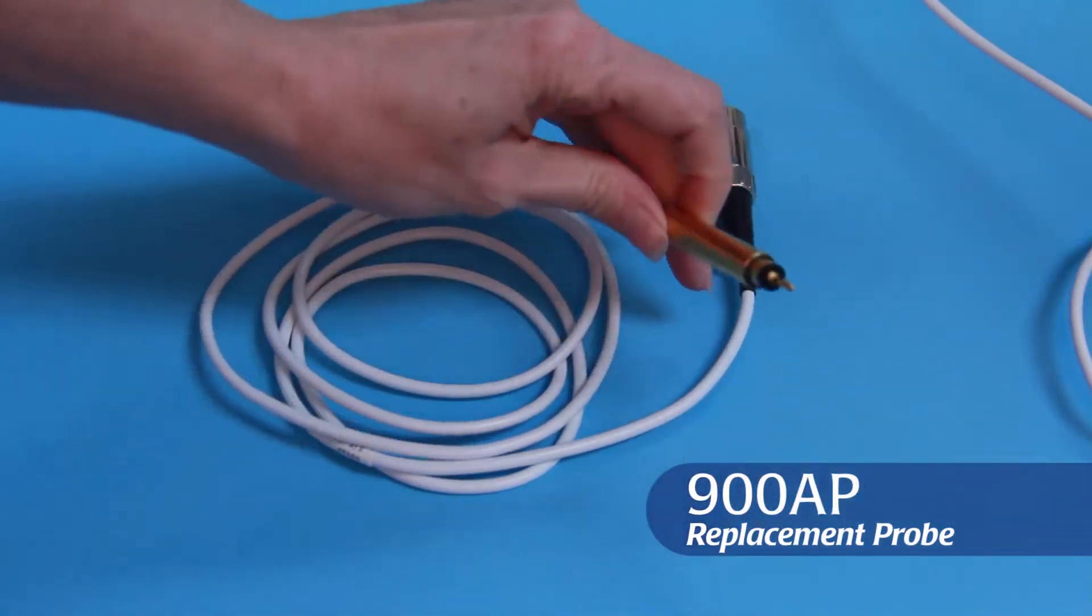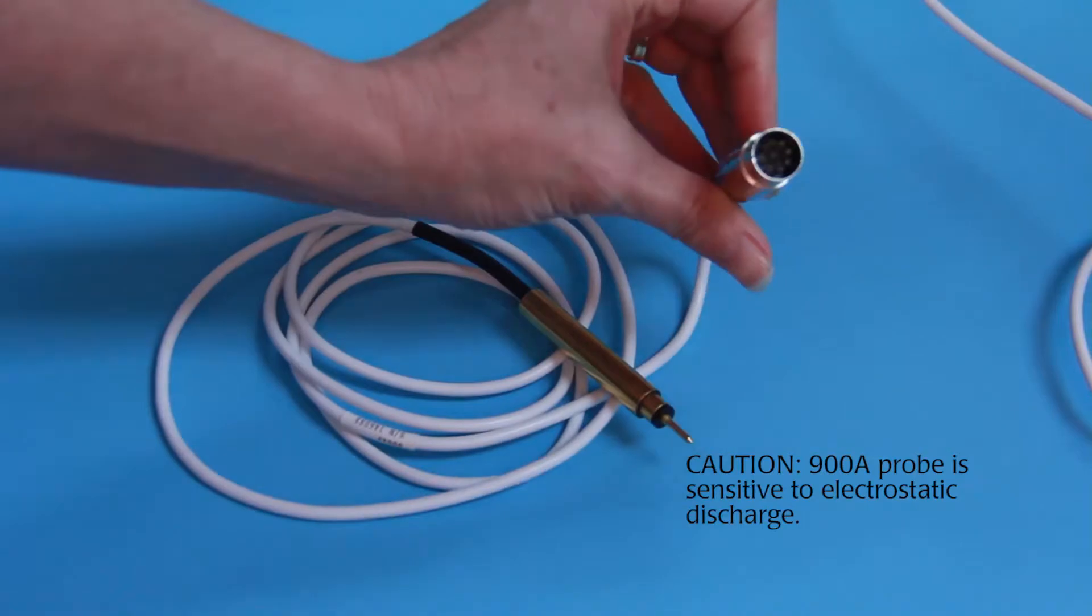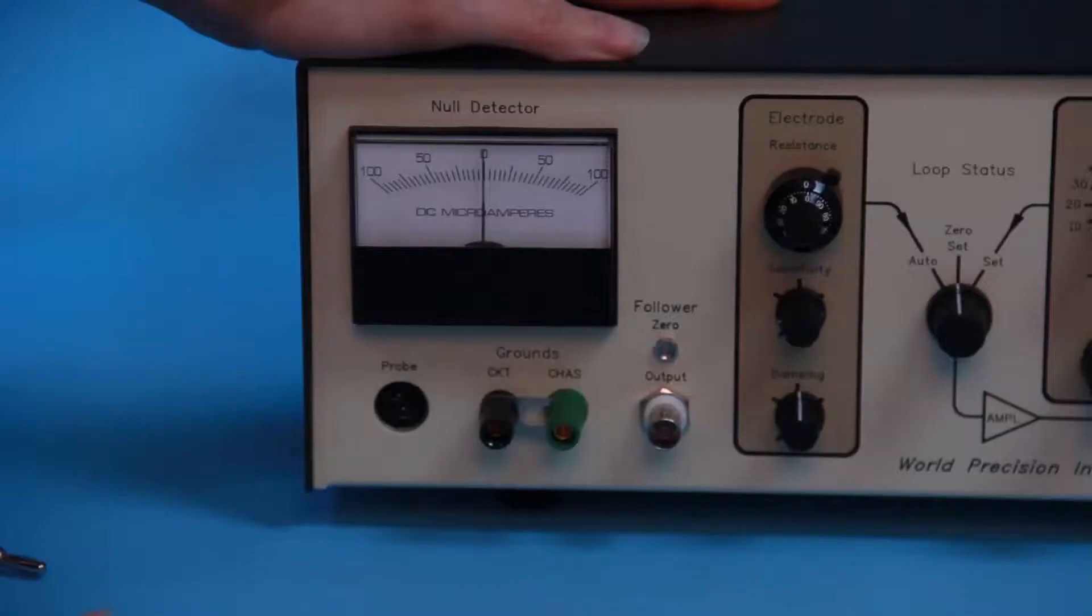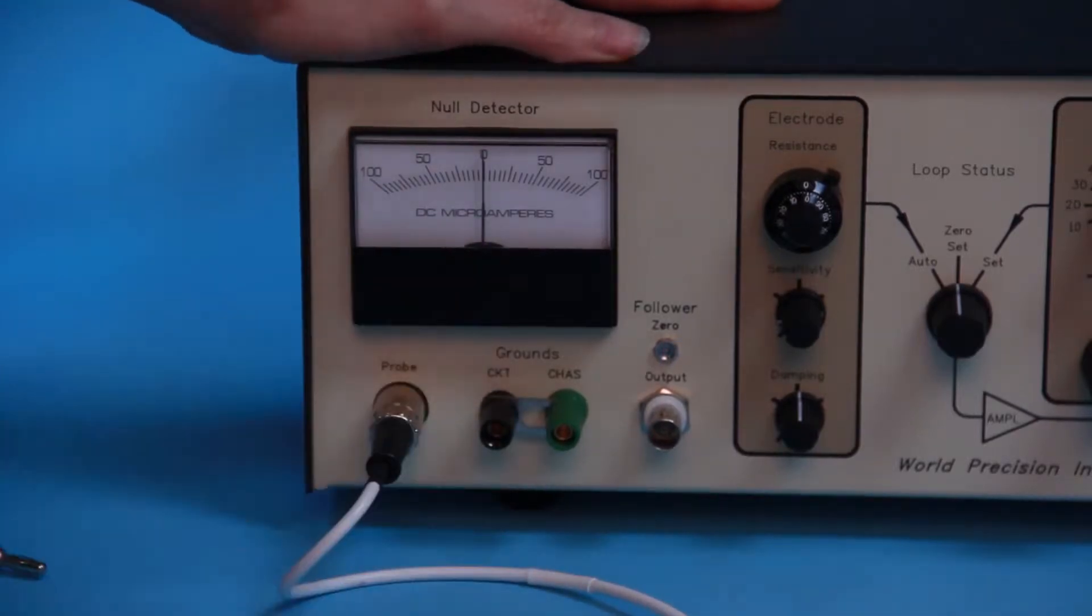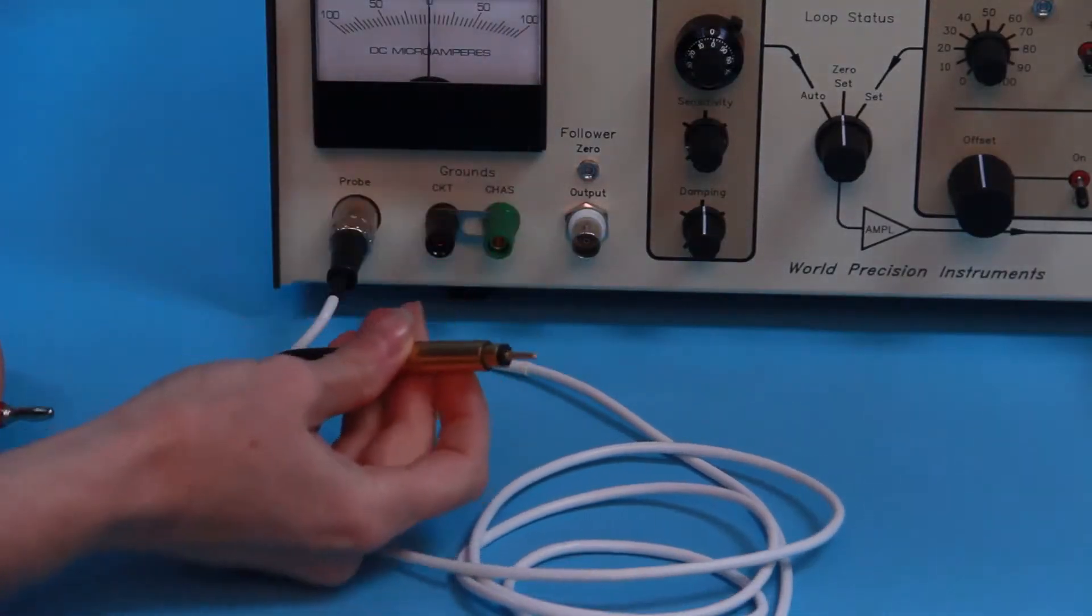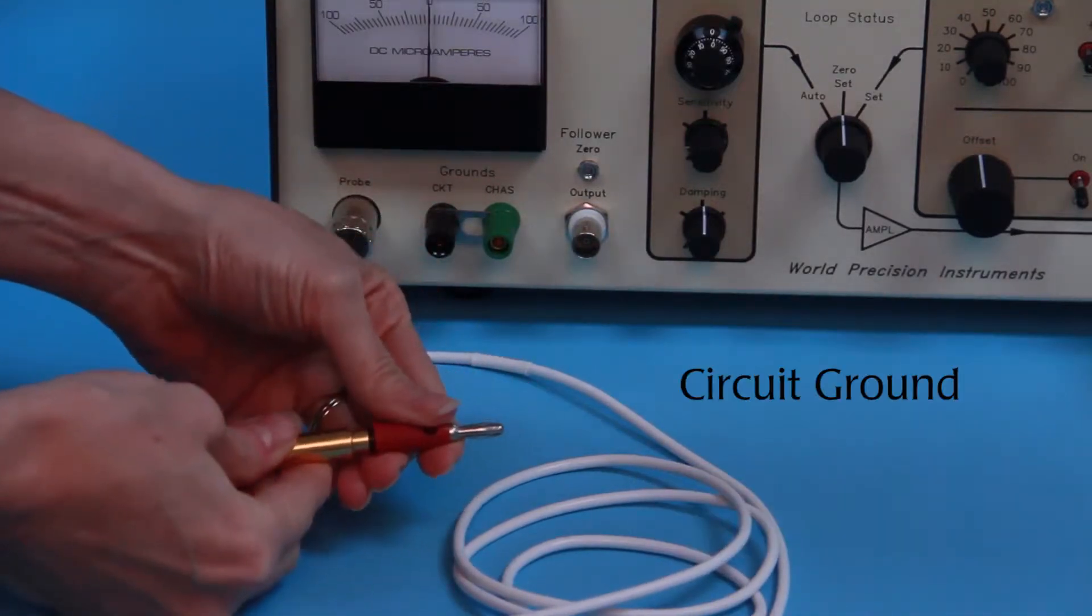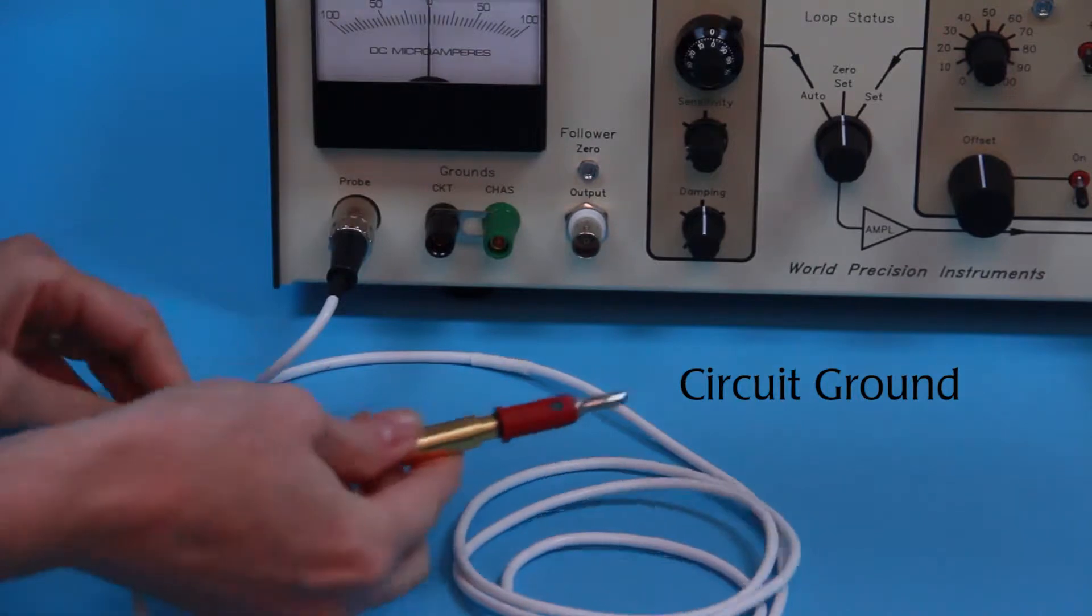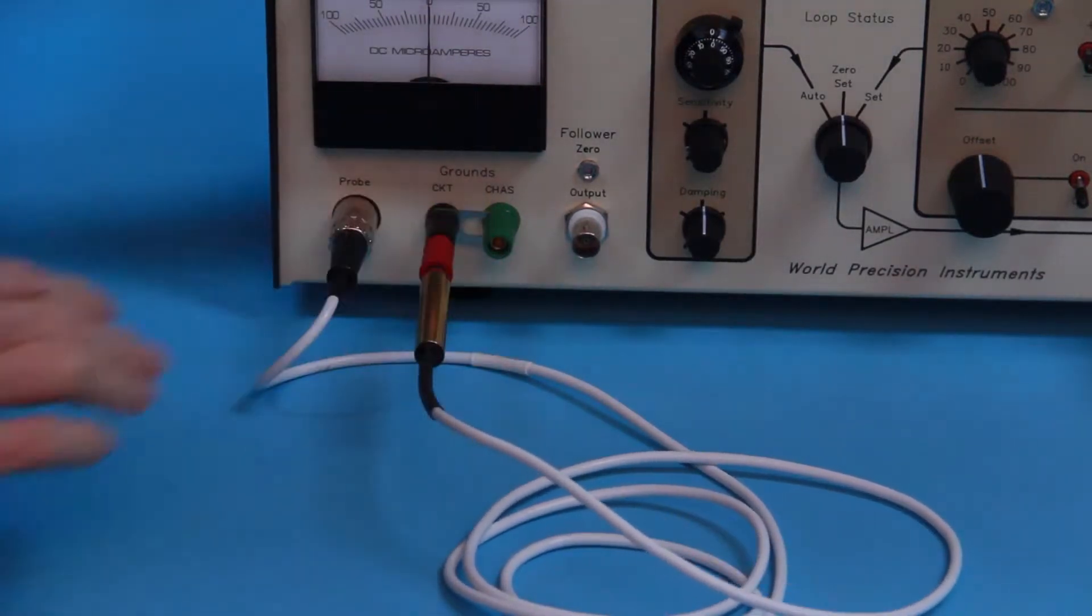The 900A active probe is packaged in an anti-static bag because it is sensitive to electrostatic discharge. Connect the probe to the connector labeled probe on the front panel of the control unit. Connect the tip of the 900A active probe to ground using a banana to 2 millimeter pin adapter. Use the CKT ground connections, which should be electrically connected with the chassis ground by a metal strap.